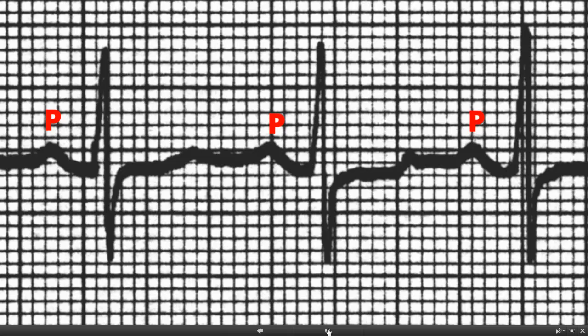Now we're going to do something new called the PR interval. It's where does the P-wave start — about right here — that's the SA node firing. The P-wave would be the atria responding to that. The signal then goes into the AV node where it is delayed prior to entering the ventricles, so the QRS is when the AV node releases the impulse. The interval from the beginning of the P-wave to when it leaves the AV node should be no greater than 0.20 seconds or five small boxes. If it's longer than that, we would call that a first degree heart block. This one is not.